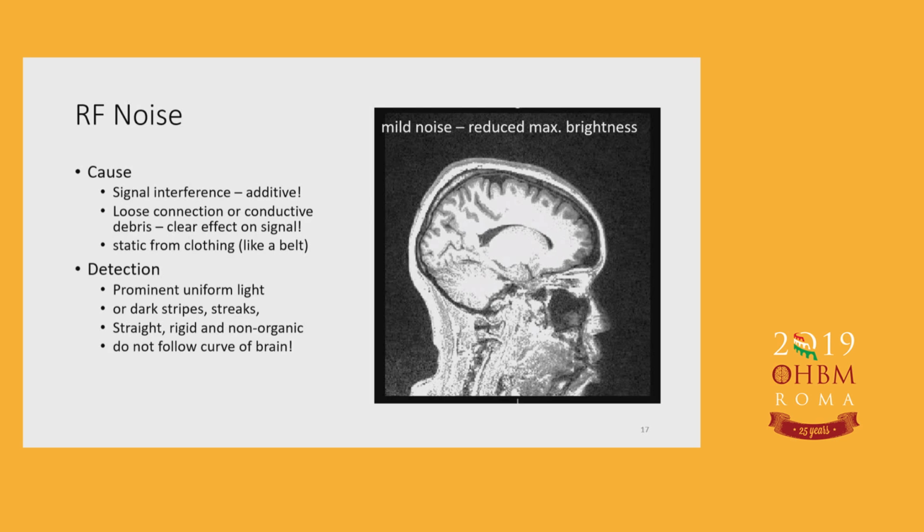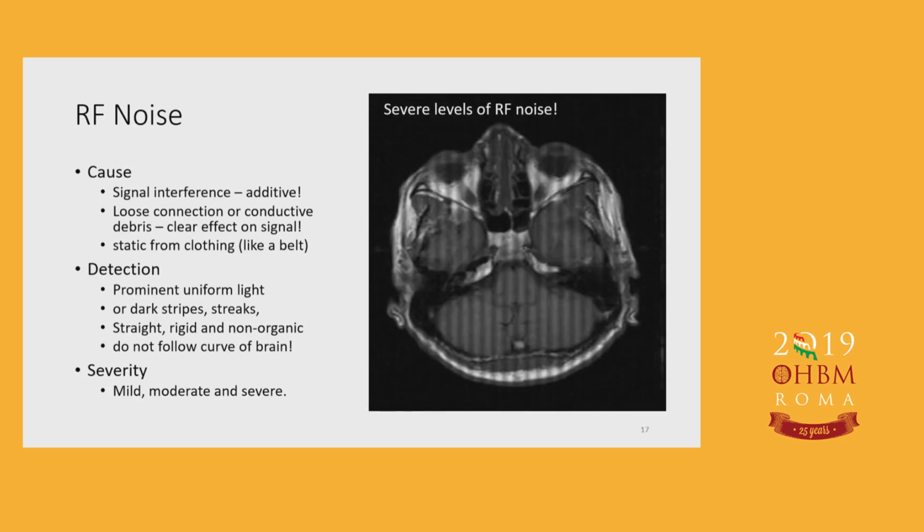It's usually straight, rigid, and inorganic. It does not follow the curve of the brain, unlike the other ones I described just a few minutes ago. There are different levels of severity for this too. I'll give you more examples now. For example, this is pretty bad.